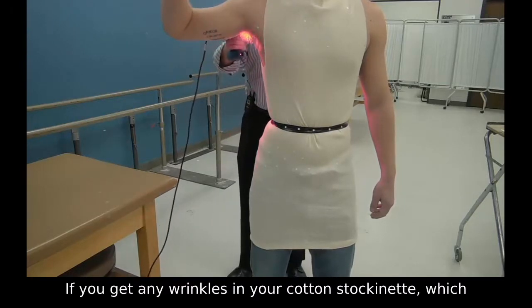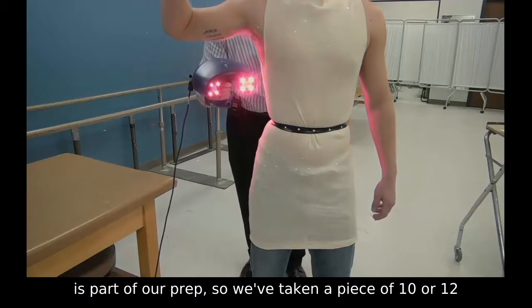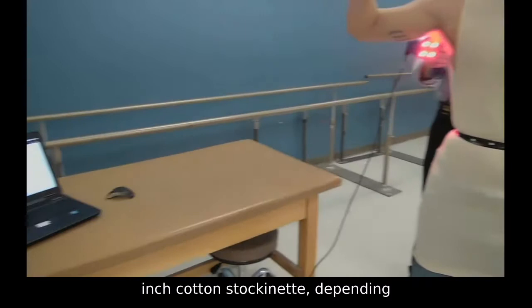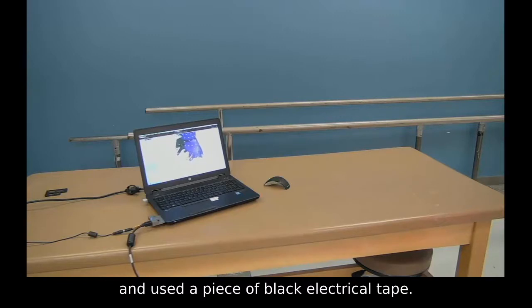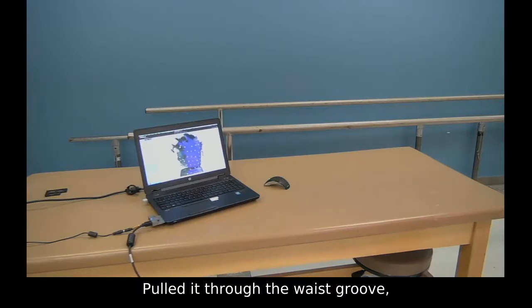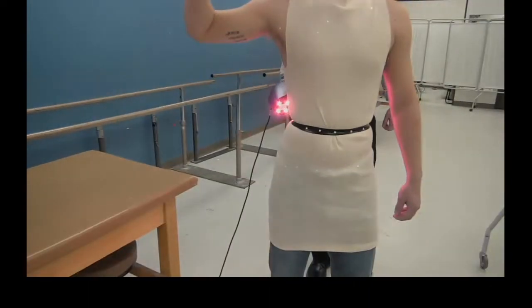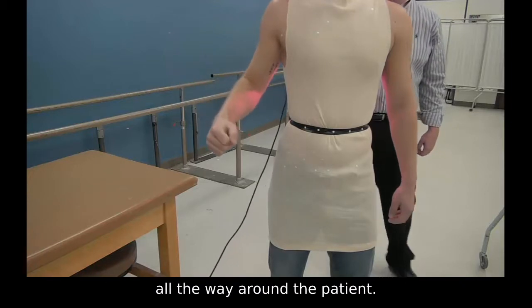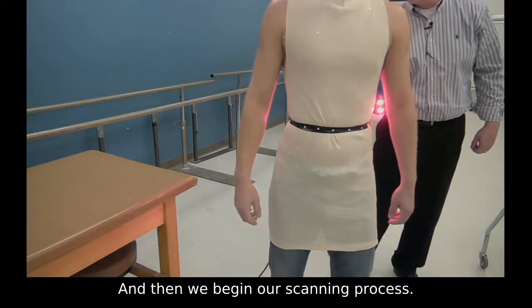If you get any wrinkles in your cotton stockinette, which is part of our prep, so we've taken a piece of 10 or 12 inch cotton stockinette, depending on the size of your patient, pulled that over the patient, used a piece of black electrical tape, pulled it through the waist groove just to help identify that area. Place the dots every inch to inch and a half all the way around the patient, and then we begin our scanning process.